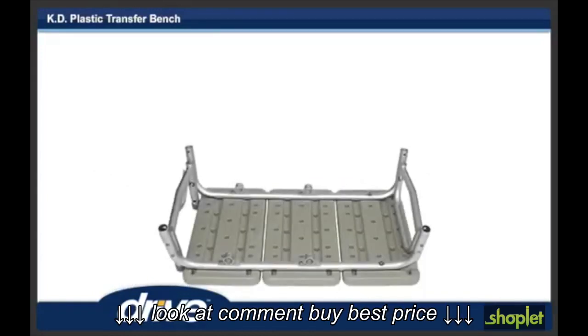Step 2. Lay transfer bench upside down on a flat surface.